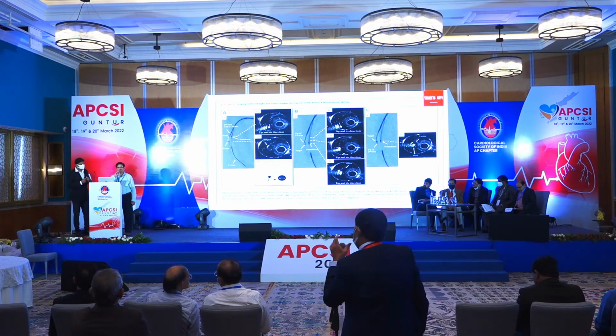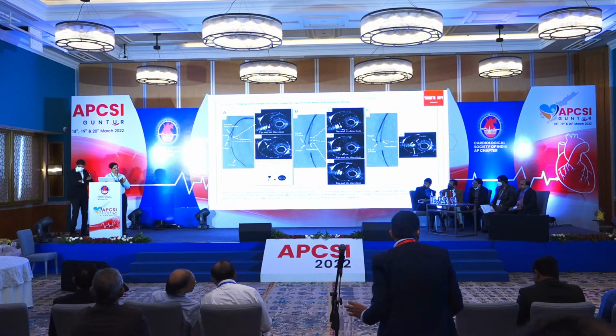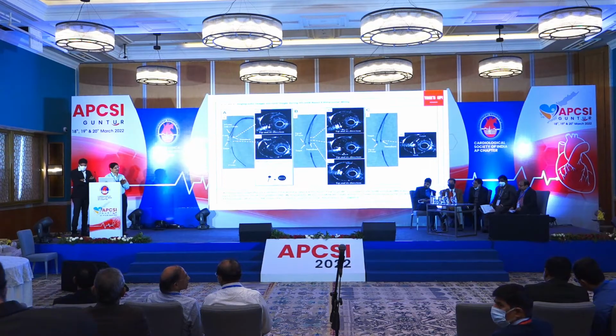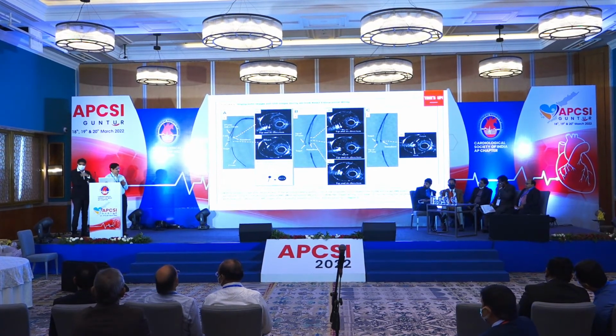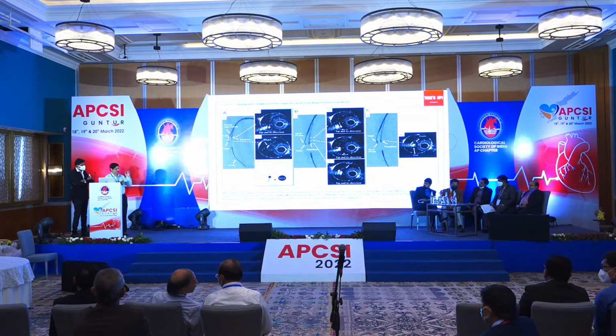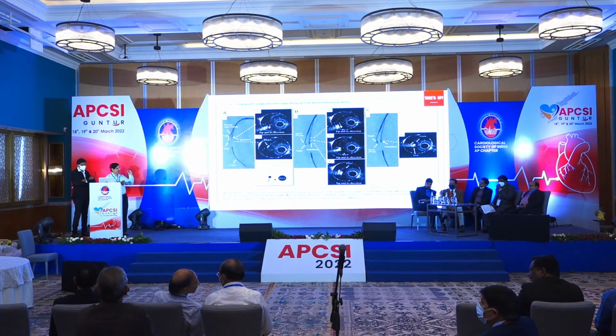Simon, for you, the important point is, as we know, ACS is caused by rupture, erosion, and of course SCAD and calcified nodule. In a small percentage of young patients where haziness is seen on the angio, if you do OCT for those patients, it is just plaque erosion, which means you won't see a rupture, only some adherent small white clot.